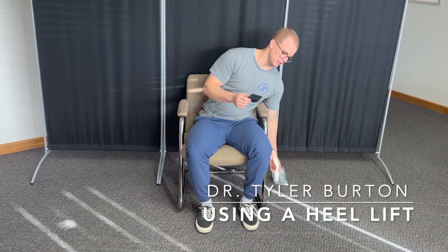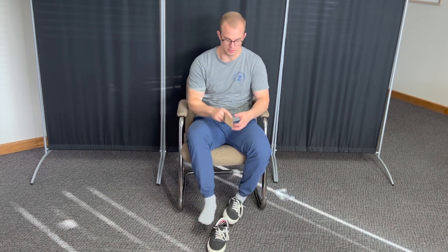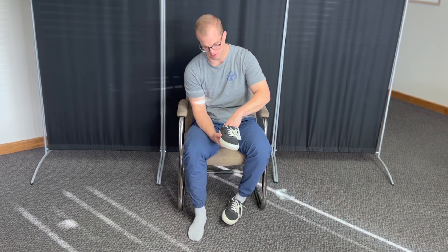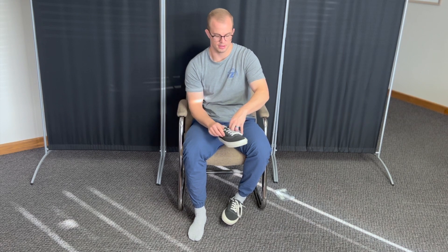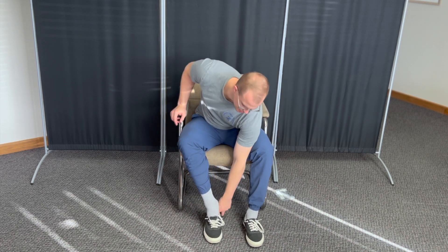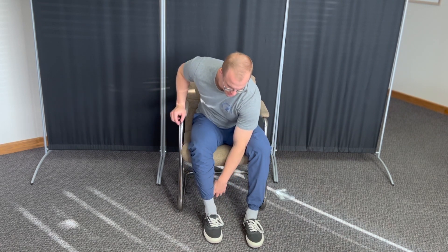When using the heel lift, take the heel lift out. You can see there are often three levels. Most of the time, unless prescribed otherwise, you're going to take the entire heel lift and slip it into the back of your shoe where your heel is, then reinsert your foot into the shoe. If you feel uncomfortable only having one heel lift in, you can apply a heel lift into the other shoe as well.